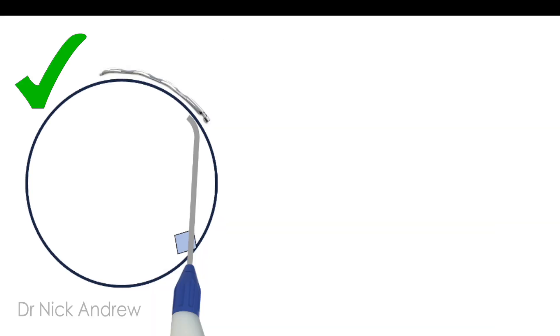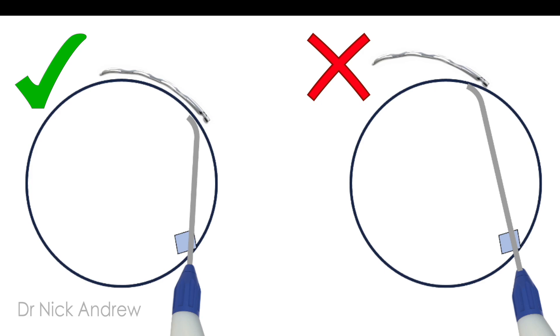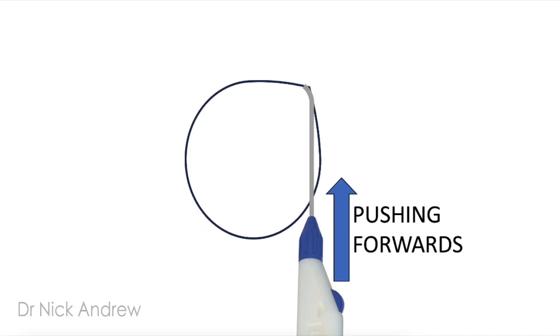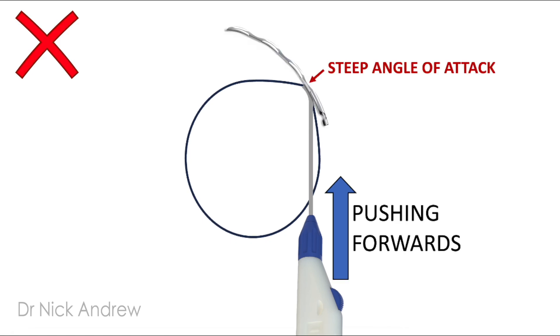You want a nice flat angle of attack. A steep angle of attack will drive the hydrus forcefully into the outer wall of Schlemm's canal and cause it to dive posteriorly towards the iris. Next point: do not deform the limbus — you must relax your hand. If you're pushing forward with the hydrus injector, you'll deform the smooth curve of the limbus into a corner or apex, which has the same effect of causing a steep angle of attack.